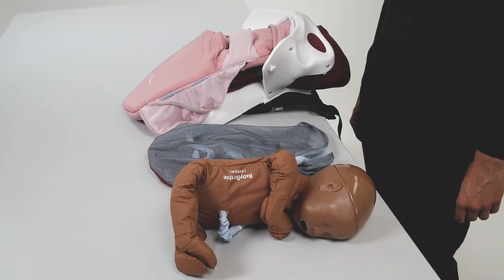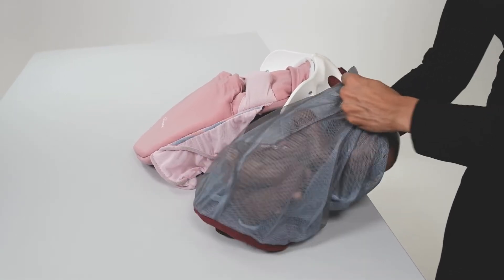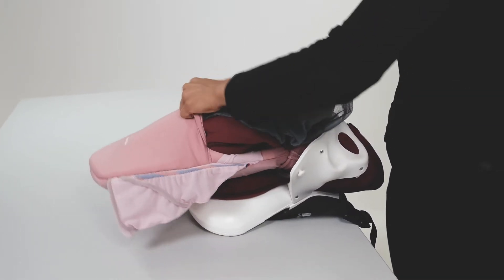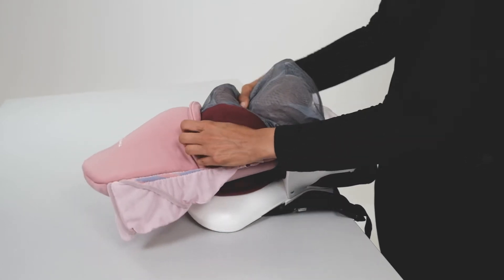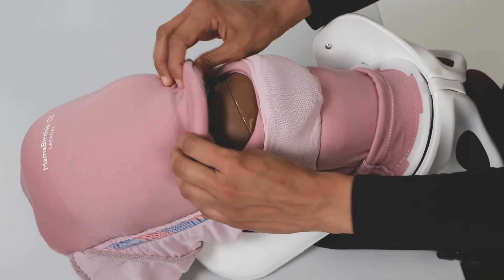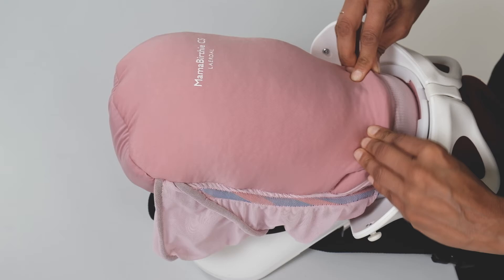The baby can be placed in different positions depending on the simulation scenario. Place Baby Berthy inside the membranes of the placenta. For a cephalic delivery, place Baby Berthy and the placenta into the uterus with the head down. Pull the lower part of the uterus over the head. Align the opening of the membranes with the uterine incision site.